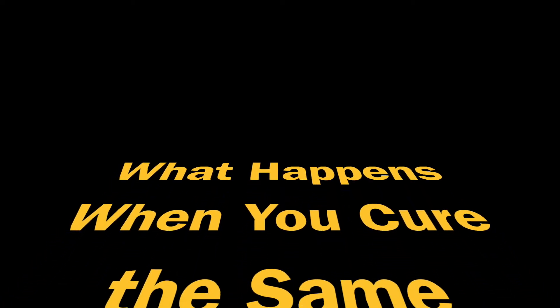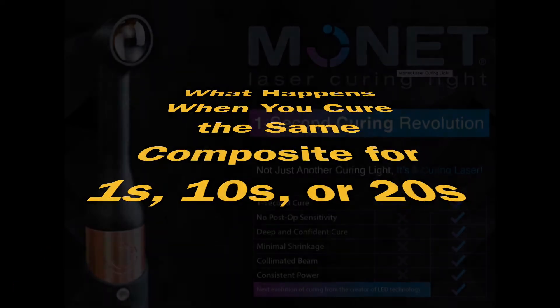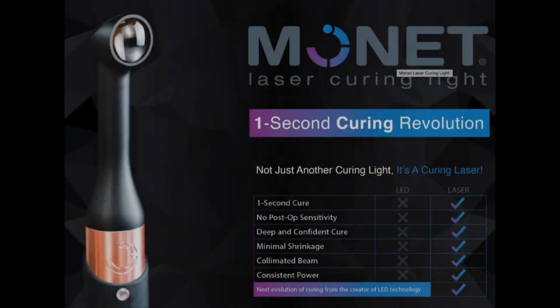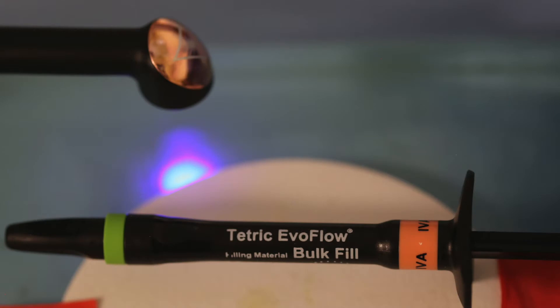In this video, we'll look to see what happens when you cure the same composite for 1 second, 10 seconds, or 20 seconds. To deliver 1 second, we use the Monet 1-second curing light and we use Tetric Evo Flow Bulk Fill.